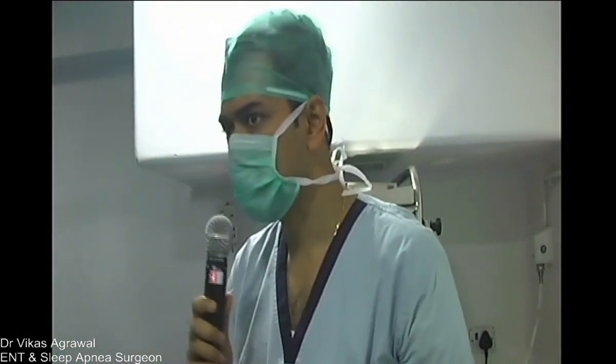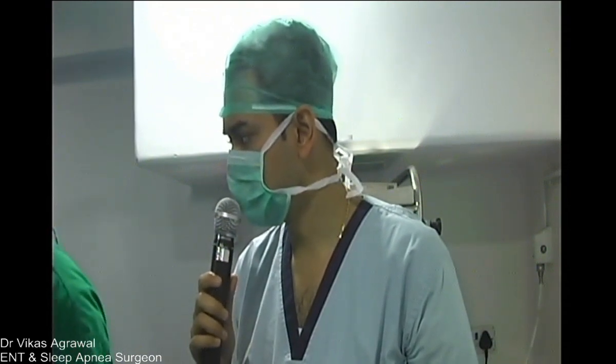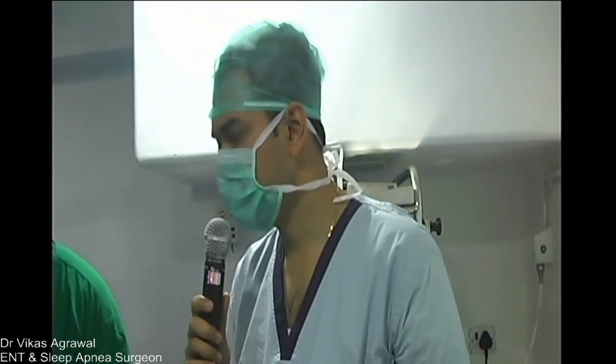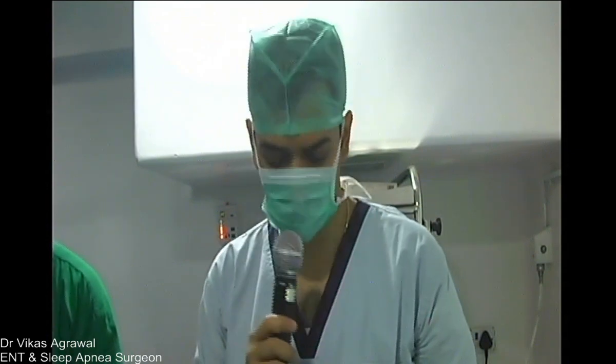Right, right. We'll try to demonstrate high septal deviation. Where is the septum? How much is to be removed? Right. So we are just continuing setting up the navigation unit and to have everything in place for everybody to see.